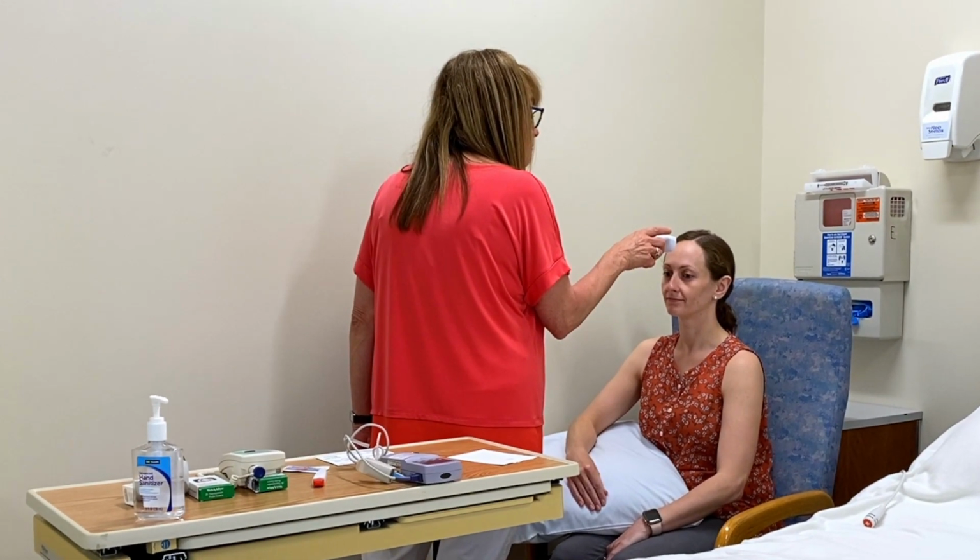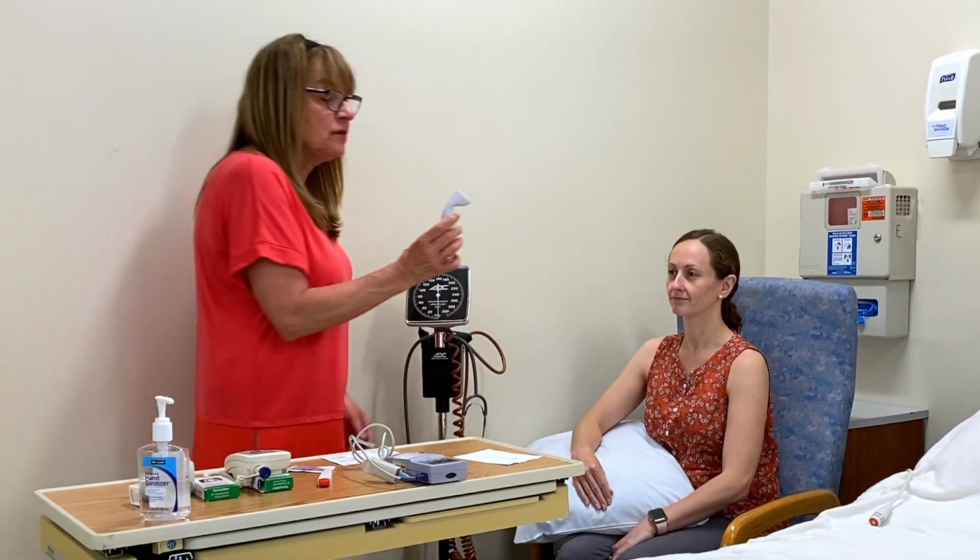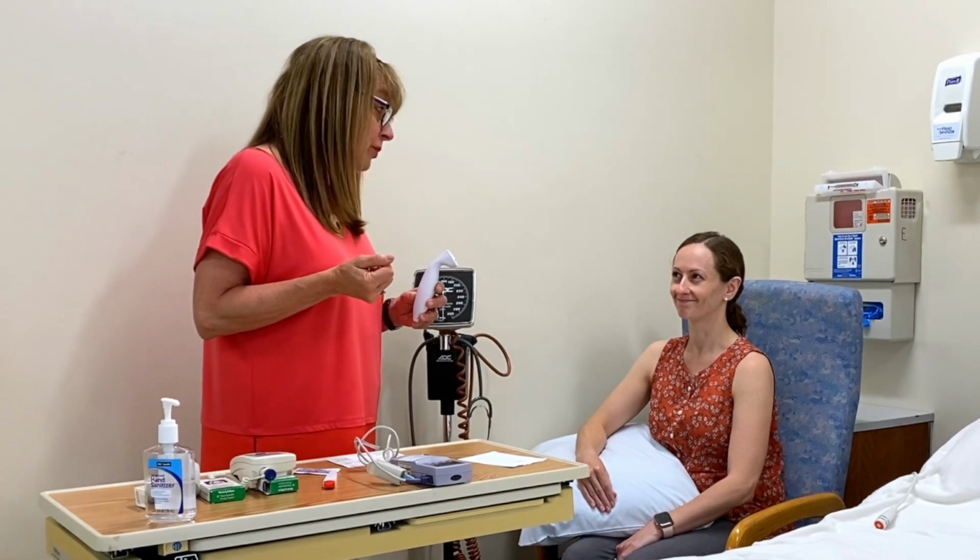Okay. Now, temporally, her temperature is 99.1. And again, it's supposed to be more accurate than orally.